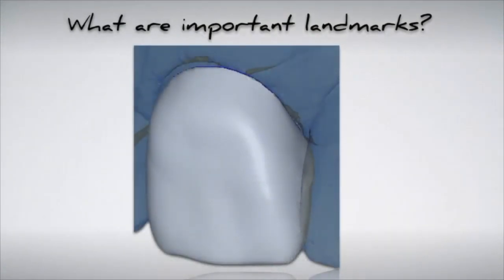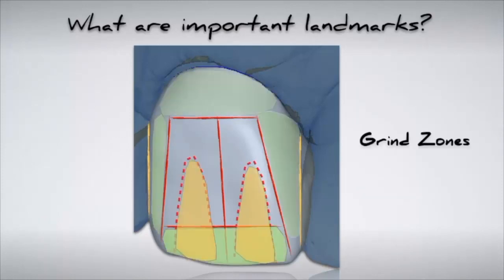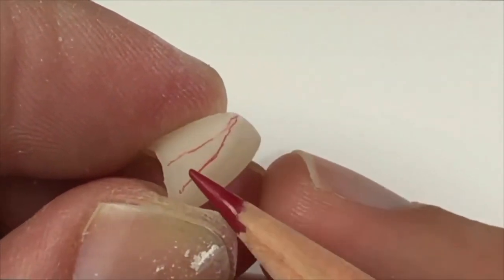When reshaping and contouring the facial aspect of anterior restorations, the important landmarks must be identified. A simple way to do this is to manually draw these landmarks on the restoration. The useful landmarks to identify are the mesial and distal line angles, the cervical height of contour, the incisal one-third, and the developmental depressions. By doing this, the areas of grind zones can be identified to guide you on reshaping and contouring. To identify these landmarks on the restoration, a red pencil is used.